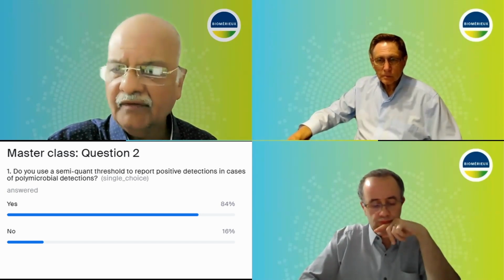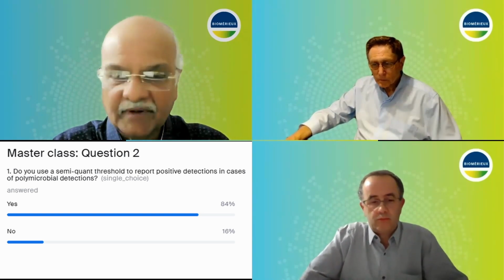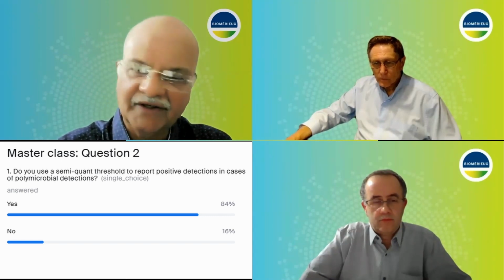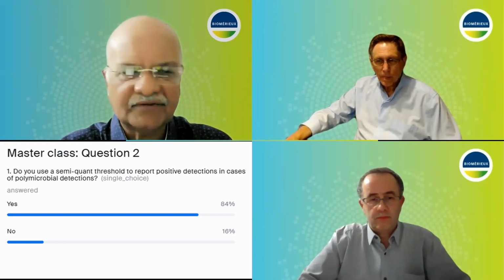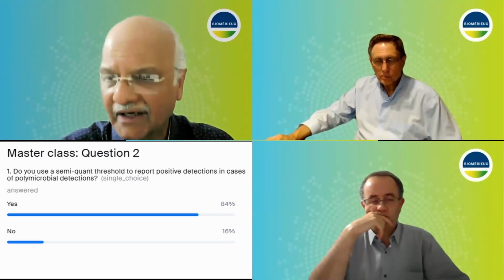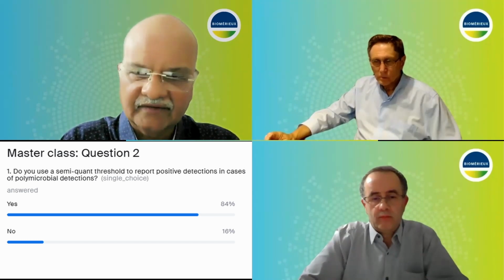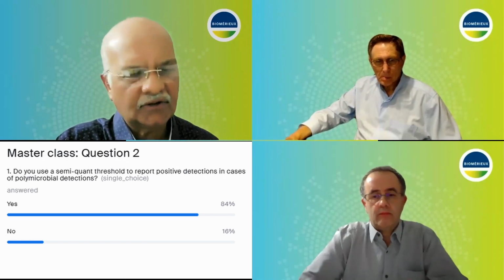And while we are on this topic, I'd just like to inform Dr. Septimus perhaps that Staph aureus is not an important pneumonia organism in large parts of India. So many recommendations which involve that, and sometimes we do recover a low number of Staph aureus, and then we don't pay too much attention to that because most of the problems, even in hospital acquired and ventilator associated, are related to gram negatives. But certainly, coming to the question, it's very, very important to pay attention to the bin values.